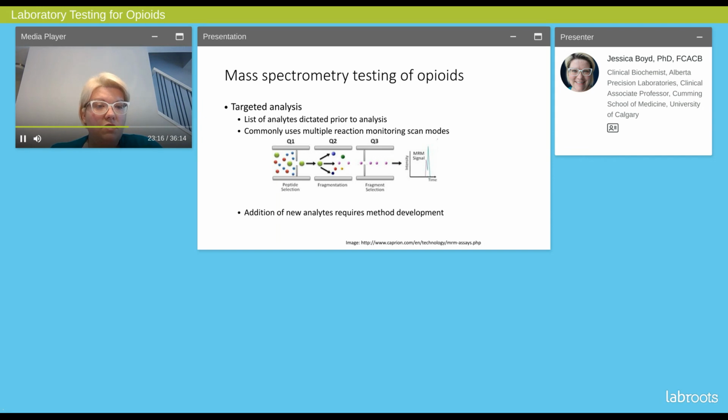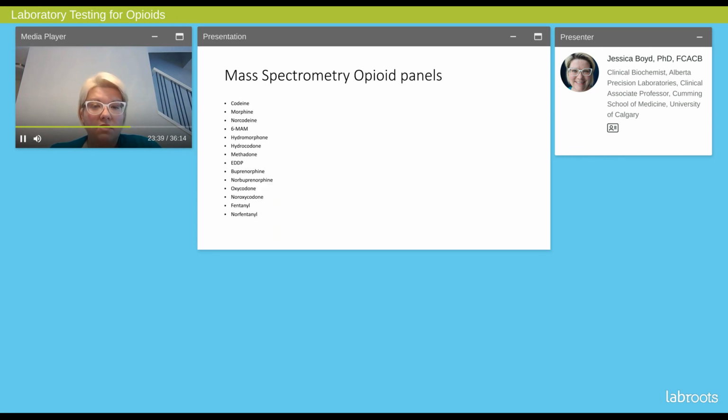If you've been paying attention to the news, we've seen over the last 5 years several new drugs start to show up in the drug supply, along with fentanyl. Carfentanil is an example, and that's one that we added to our mass spec panels. And I think I've only seen 1 or 2 little point of care devices so far for carfentanil. I'm sure people are working on it. So you can potentially move a bit faster on some of these new emerging drugs as well.